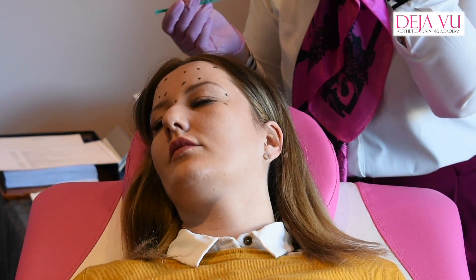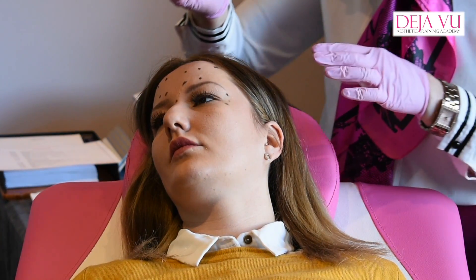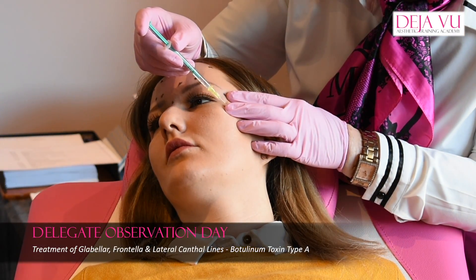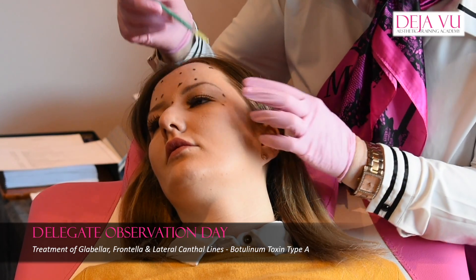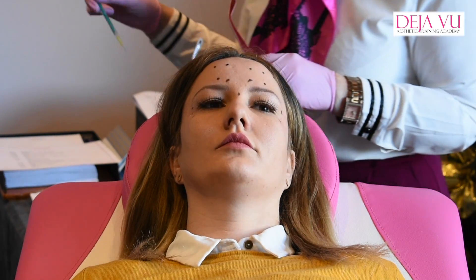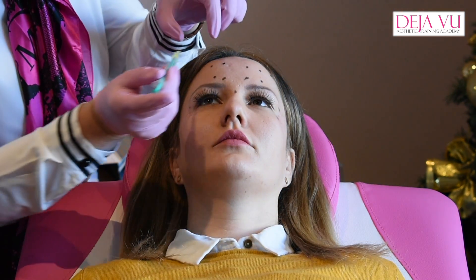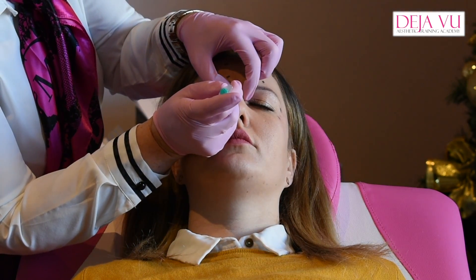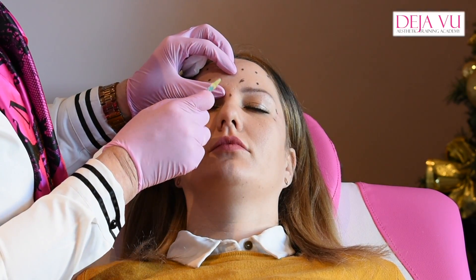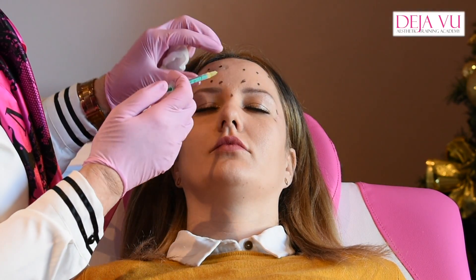I always inject from the head of the bed because I'm right-handed, so it's easier for me to work this way. Stretch your skin so you've got an easier entry. Always remember, if you're not sure about doing these little ones up here, leave it — and then when they come back in two weeks, if you need to do it then, do it then. And into this one here, squeeze the nose up. Then you're going to rest on there to protect the area and make sure you've got the angle right.